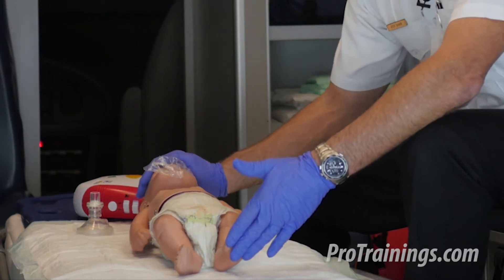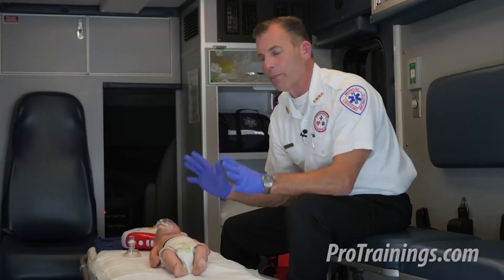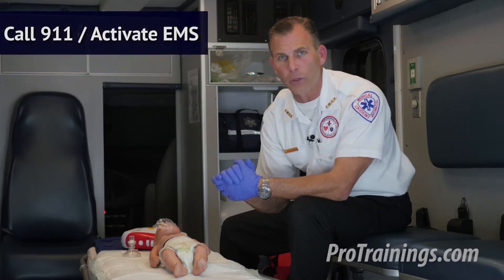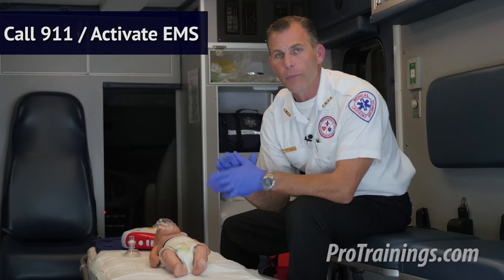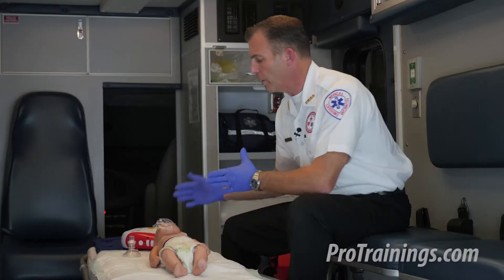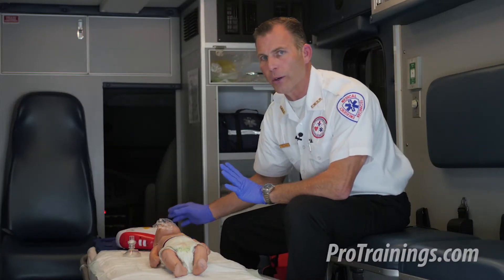Now we assess for responsiveness: "Baby, baby, are you alright, are you okay?" The baby does not respond, so we activate EMS, call 911, or call a code. If we were sending somebody to call 911, we might say, "Hey you in the plaid shirt, go call 911 and come back — I might need your help, and bring an AED if you can find one." But in this case, we actually have an AED available.